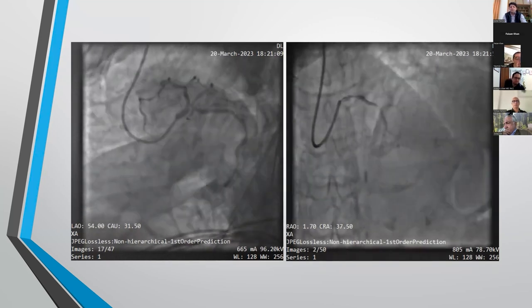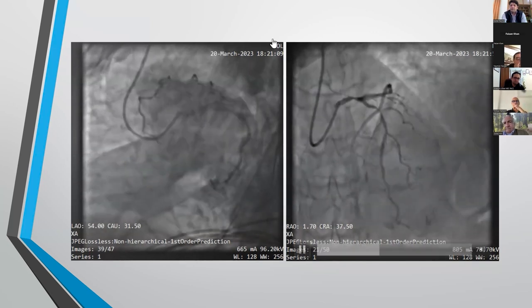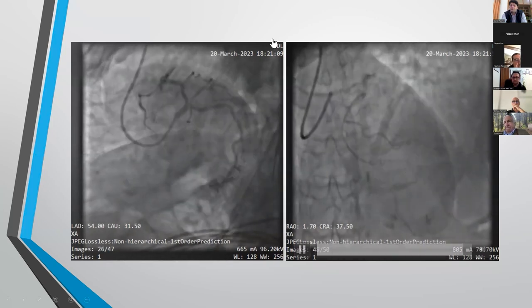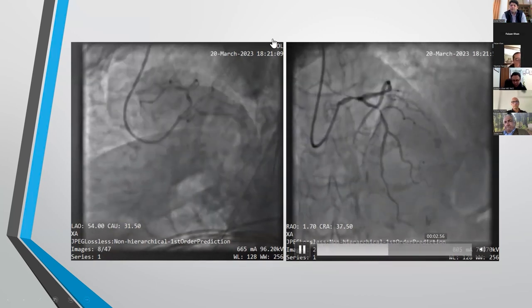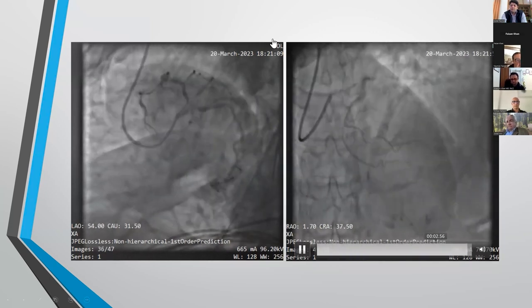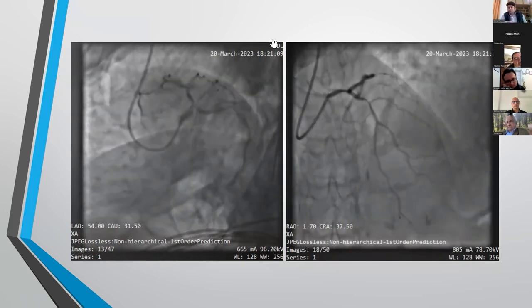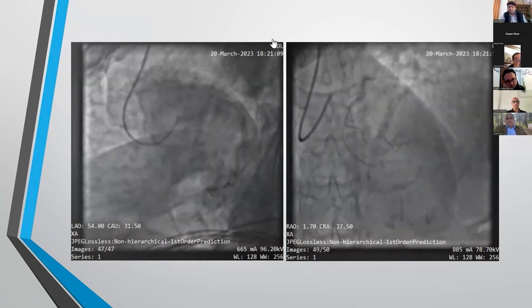Meanwhile, Usman was raising the question about what the ideal criteria for stent deployment are. So the criteria which I have adopted most commonly is to try to get a 5 millimeter square stent area in a non left main vessel, and it should be at least 90% of the distal reference lumen area. Where it lands, it should be in less than 50% plaque burden area, and there should be no edge dissection. And if you're looking at IVUS, the edge dissection involving the media should be less than 3 millimeters.